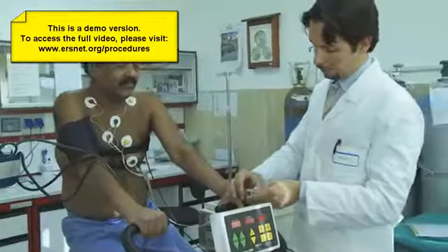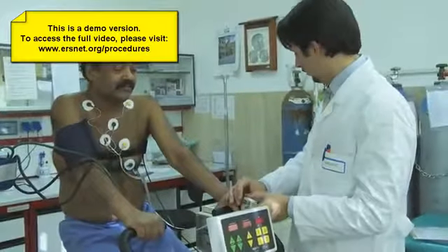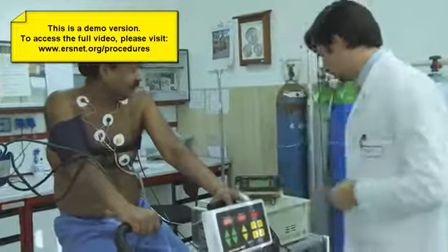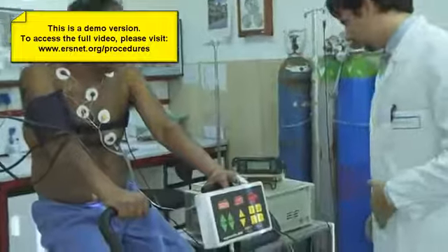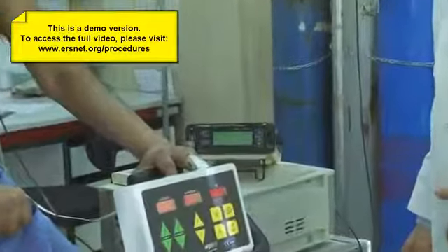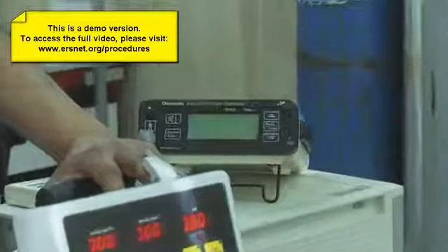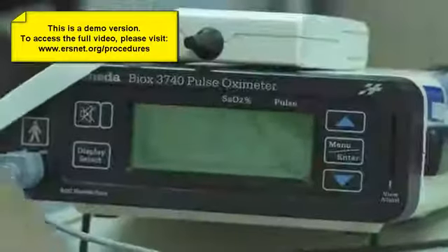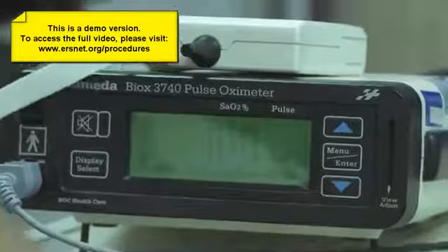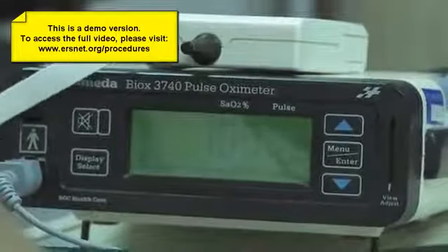Non-invasive oximetry is useful and convenient for continuous monitoring of oxygen saturation. However, some authors have reported that it tends to overestimate true oxygen saturation, while in cardiovascular disease, poor perfusion of the extremity may yield falsely low readings.